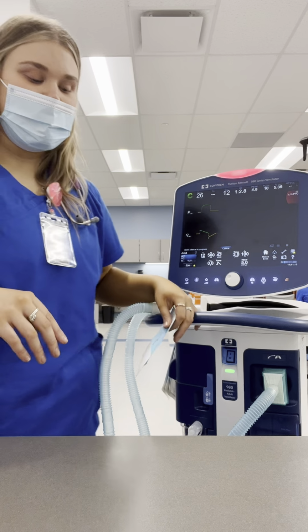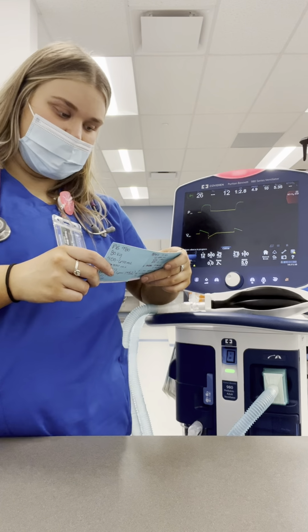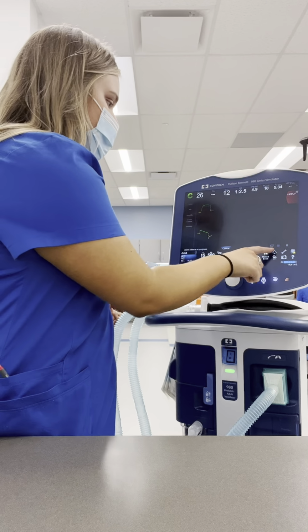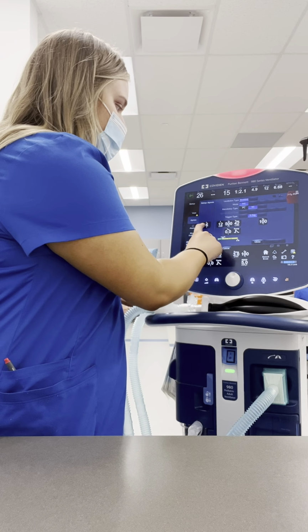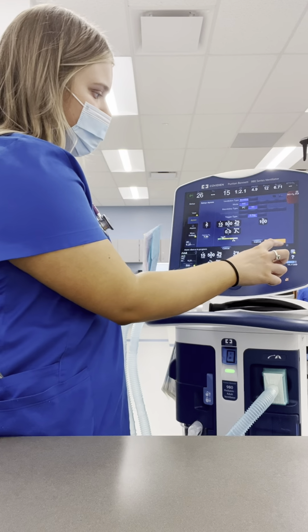30 minutes after they were put on the ventilator, we did another ABG, and we got a pH of 7.2, a CO2 of 60, an O2 of 50, and a bicarb of 26. So we are going to increase the minute ventilation to help blow off some of that CO2 because he's still acidotic. So we're going to increase the respiratory rate to 15 just to help blow off some of that CO2. And so now I'm going to go back into my apnea alarm and increase that frequency as well, just to keep everything consistent.